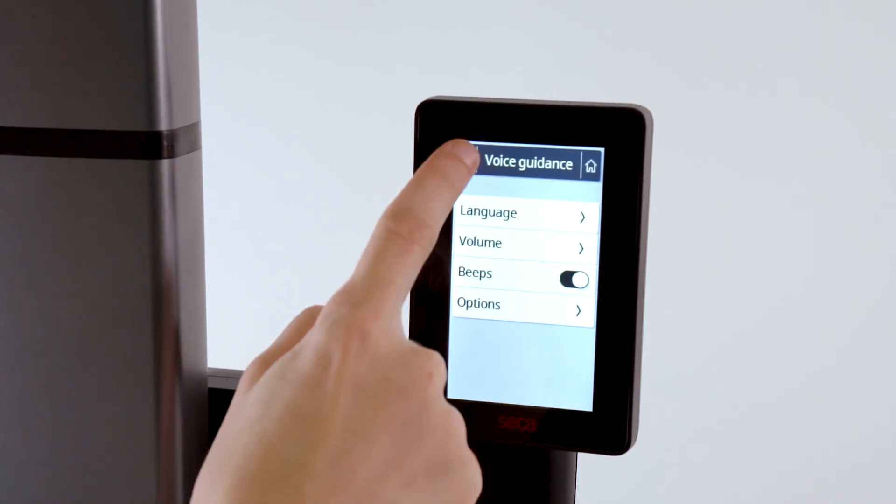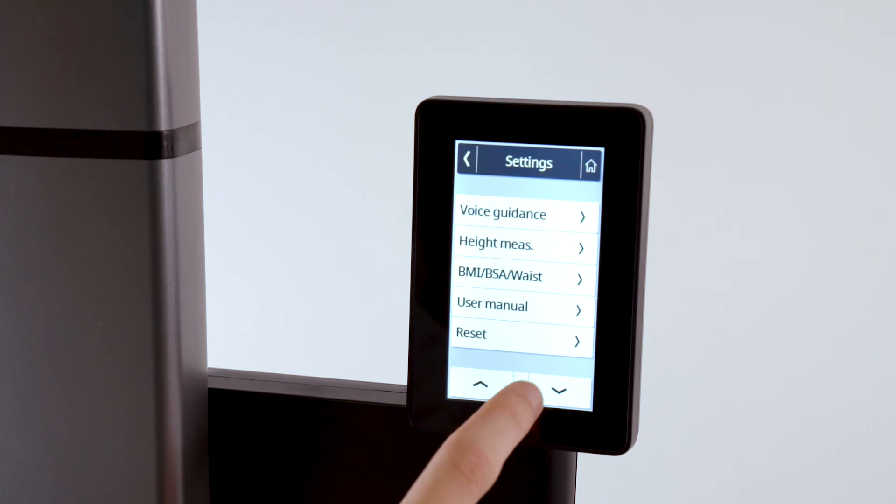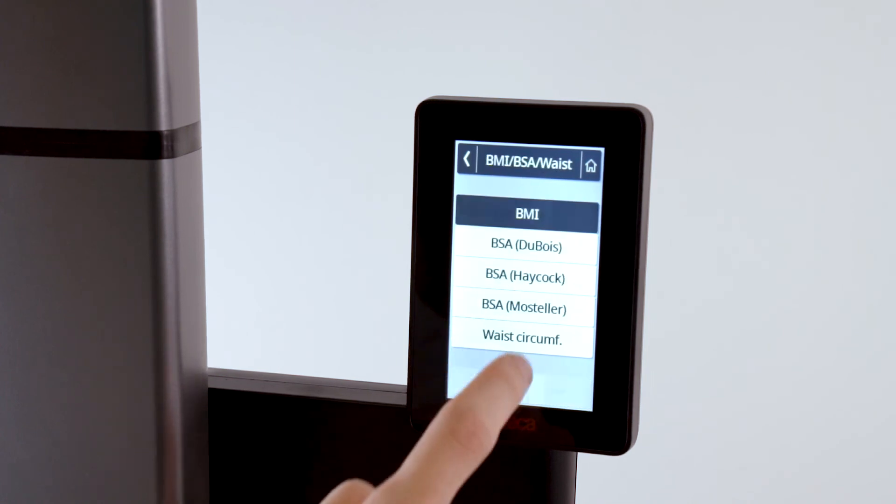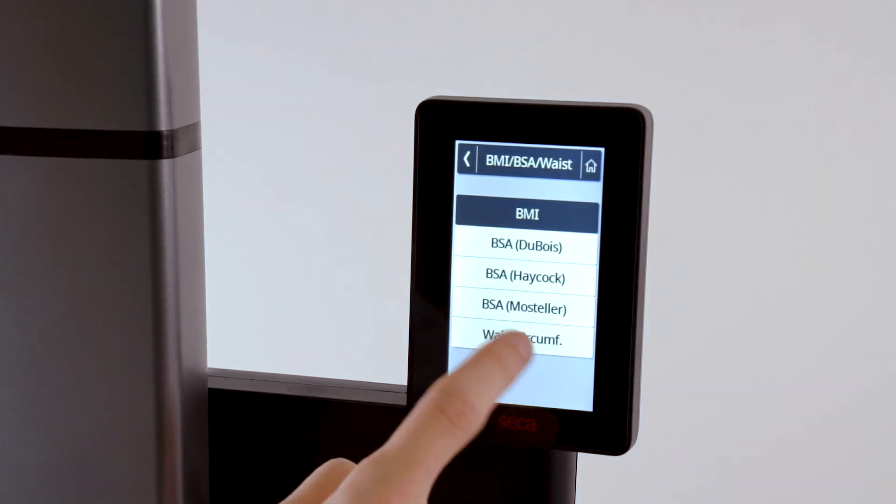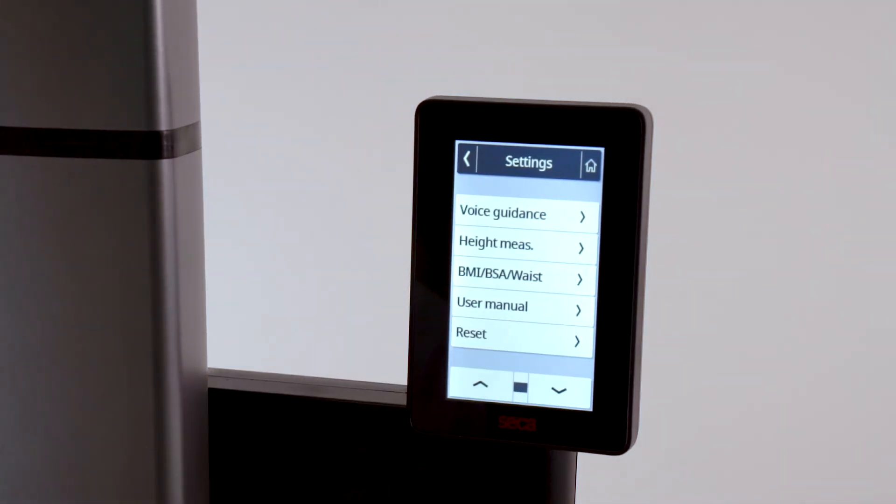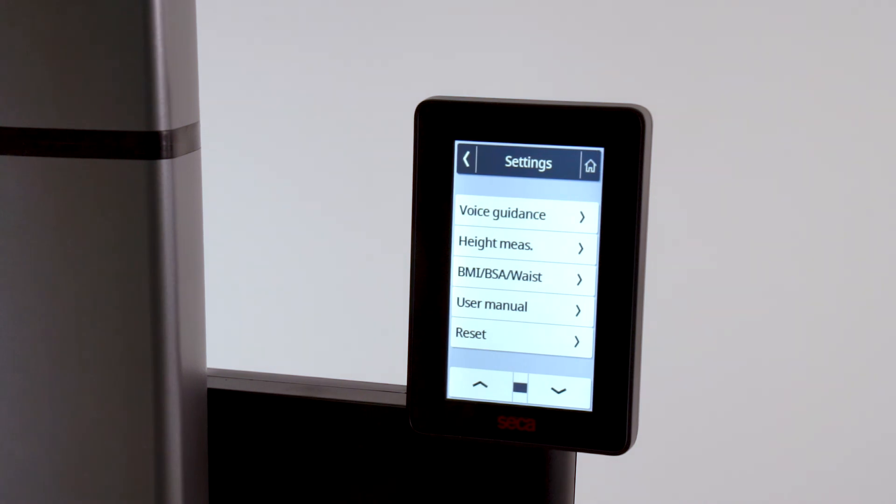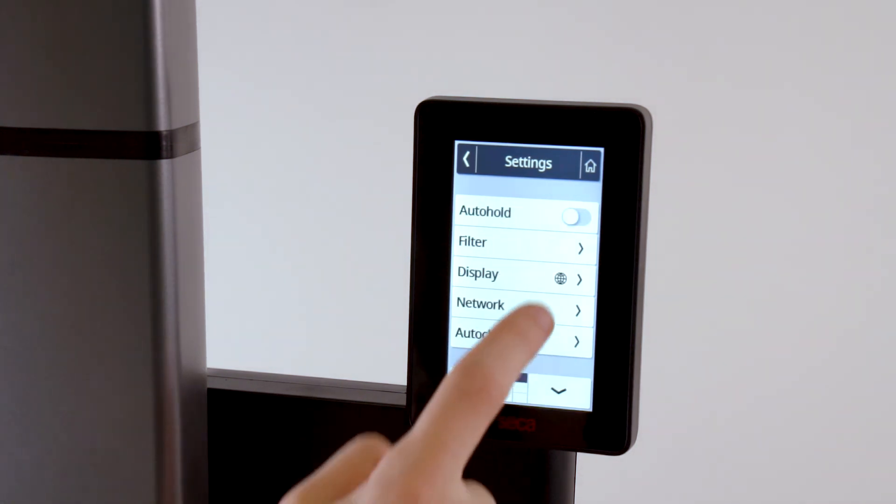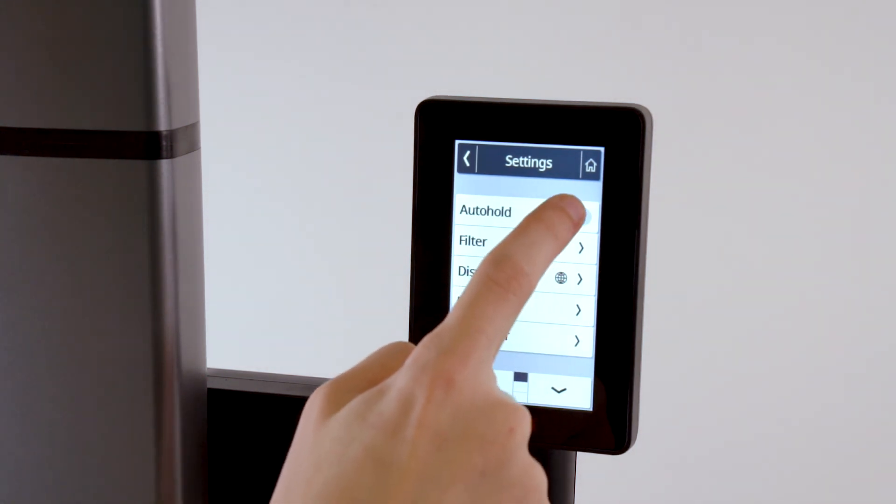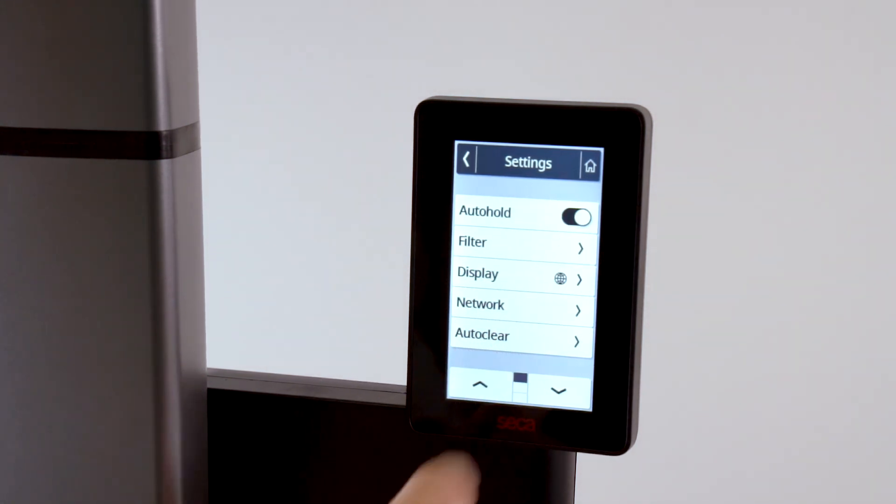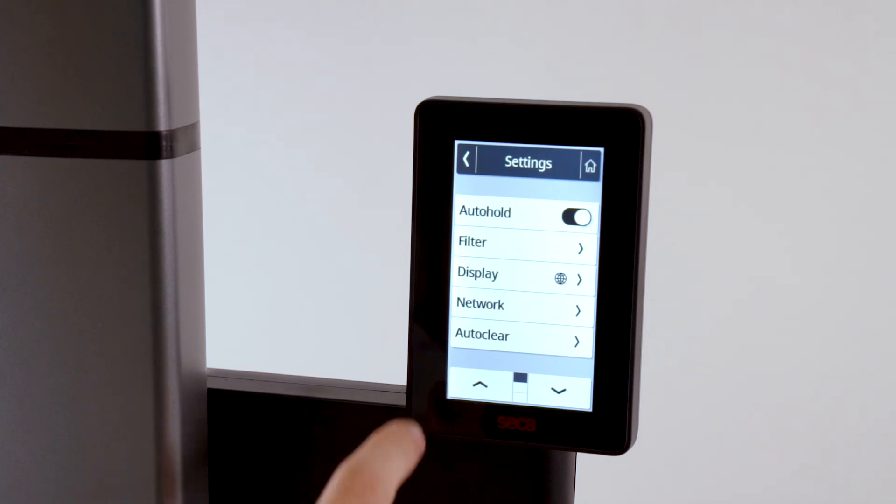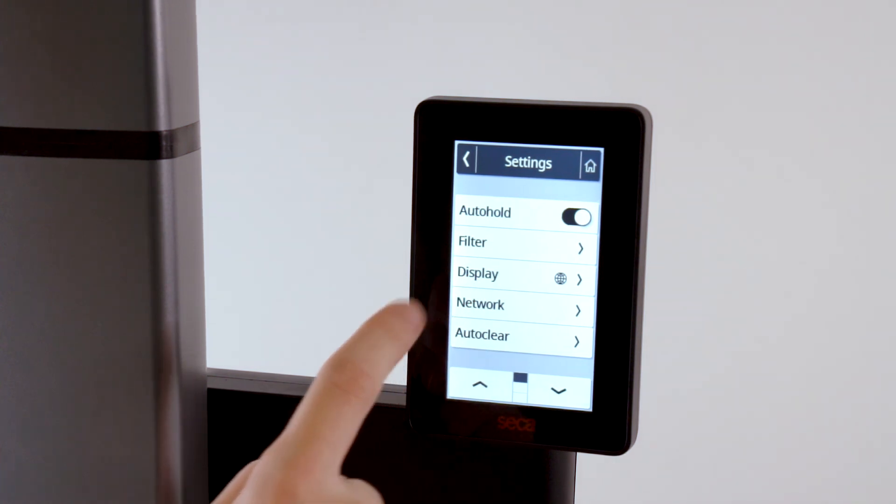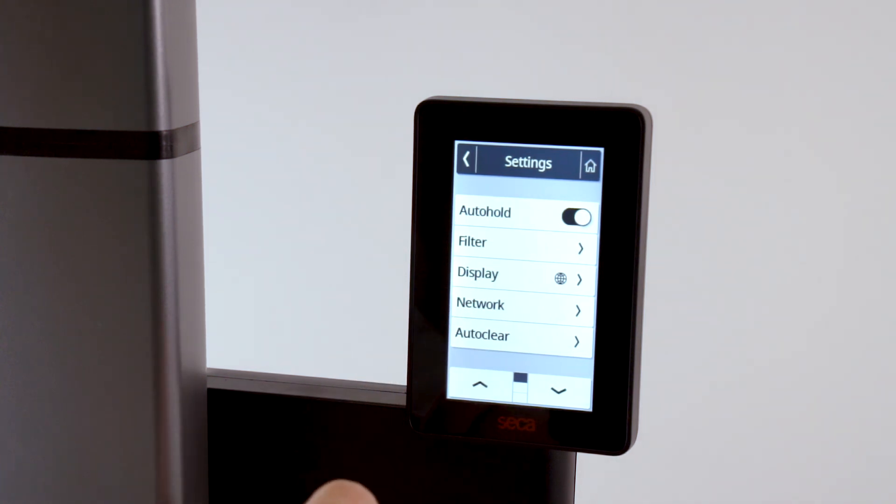Switch to the BMI BSA waist menu. Select waist circumference so that it can be entered manually on the display. Under the Auto Hold menu item, activate the hold function so that the determined weight values are automatically held on the display.